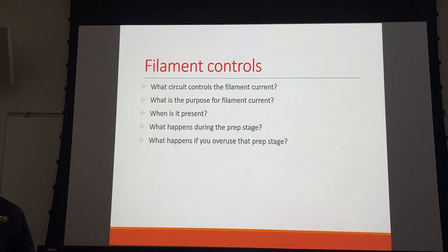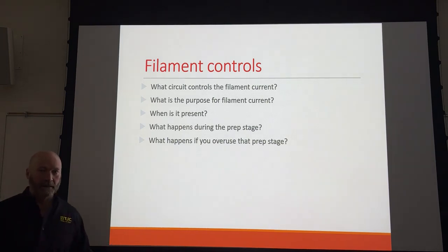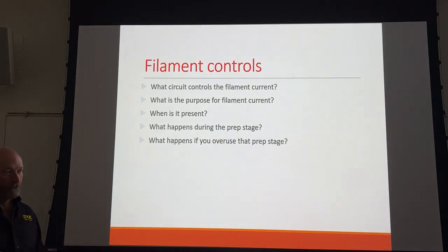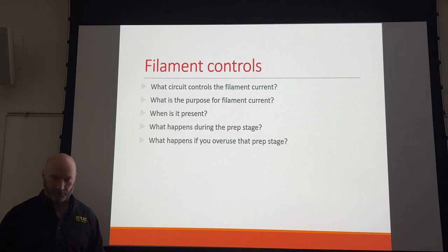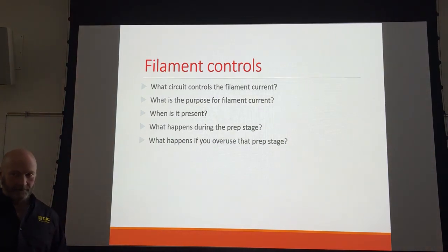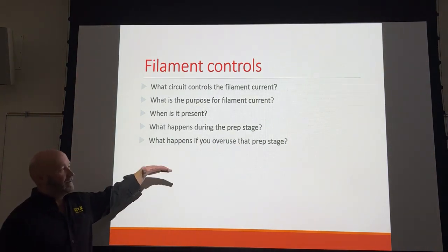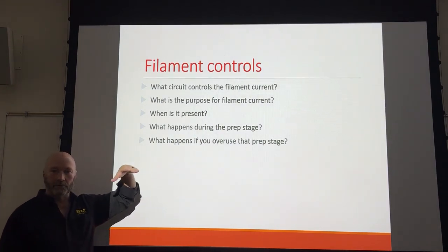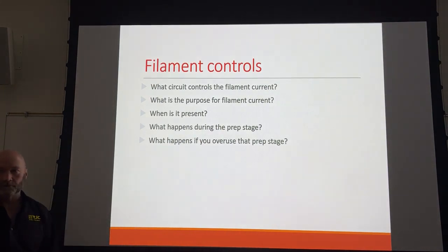So the main thing that kills your x-ray tube is heat. We create a lot of heat. If you overuse your prep button, then you create heat, right? So same answer all the way across the board. What's that going to do to the life of your x-ray tube? It's going to reduce it, right? So we've got a couple of things going on there.